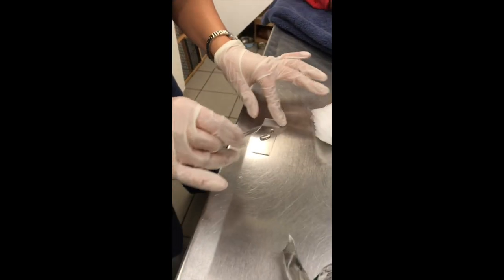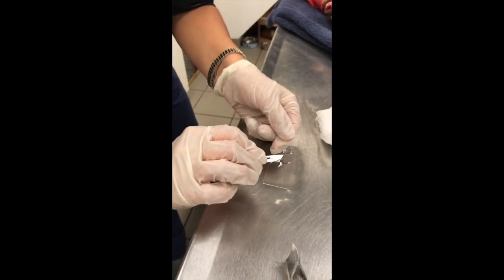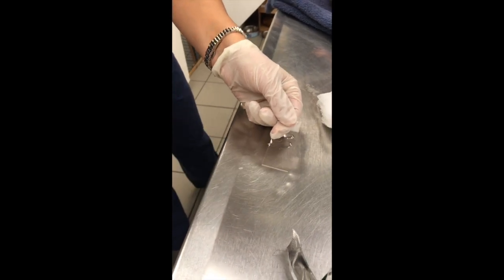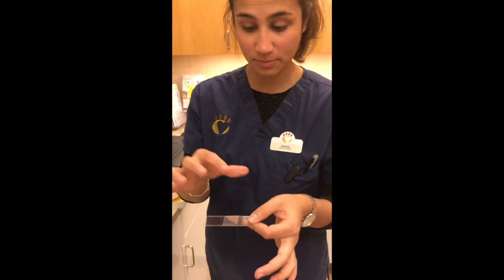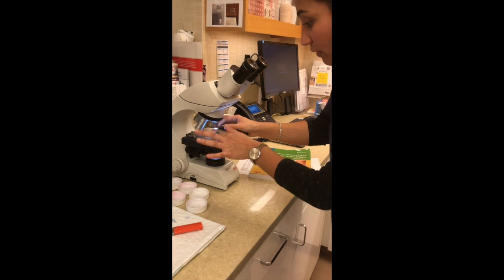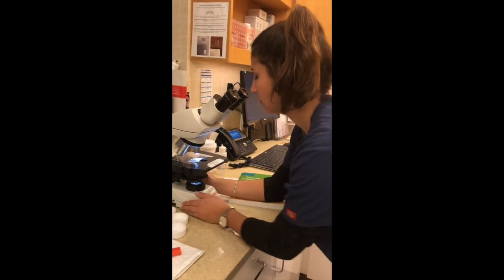Now I'm going to take my blade and just dab it on my mineral oil and scrape the excess off, just like that. Okay, so now we have our skin scraping cytology, and I'm going to first put a glass cover slide on it. Just gently place it on top. And I'm going to take a look just at our 4x magnification. Put in the notes, just say LWK to start.